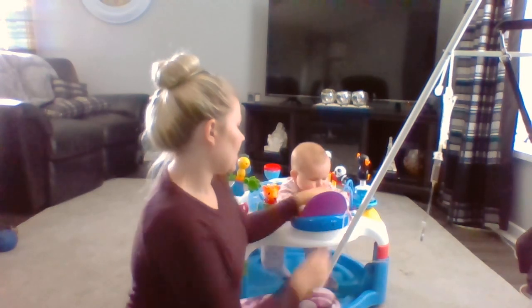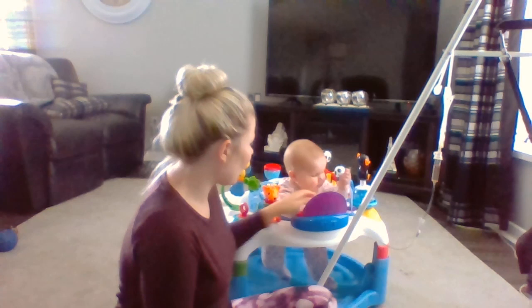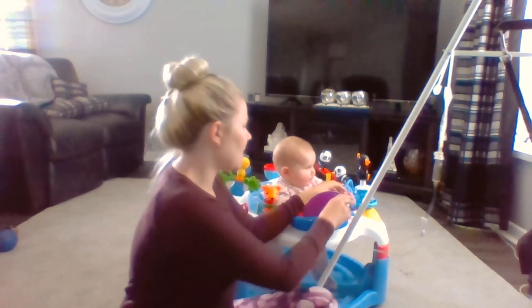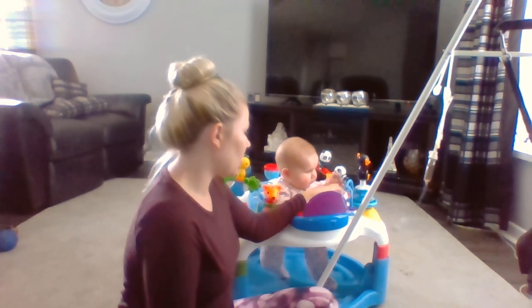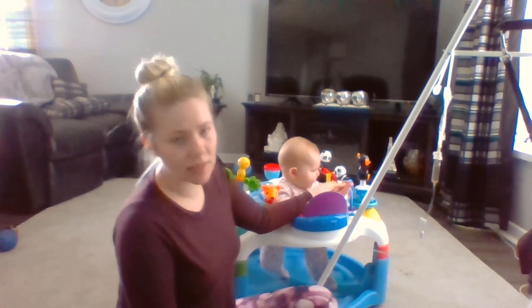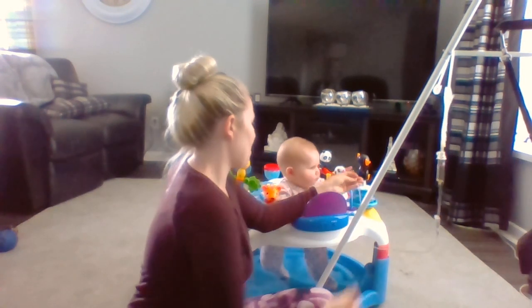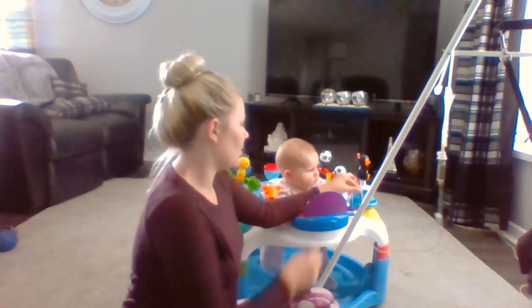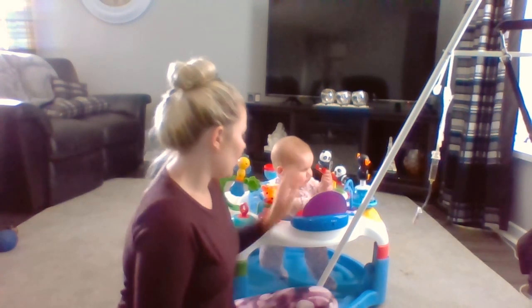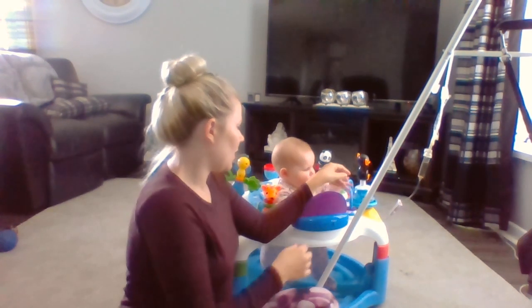Before you leave, you want to tell your patient, I have a call bell over here if you need anything. If you roll over onto this, or if you get a kink in this, it might stop the IV, so try to keep it away. Usually the line's already on their non-dominant hand. Most patients don't want to play with it, but here we are. So we don't play with the line. Okay. And that's everything.